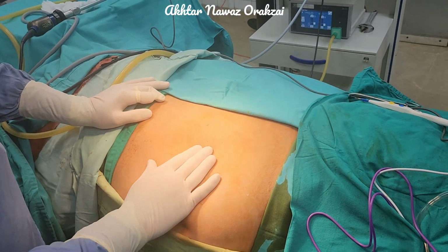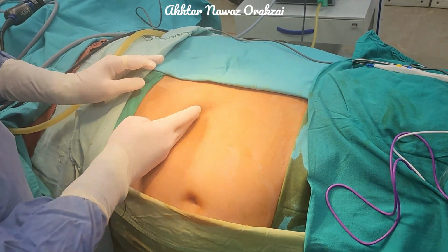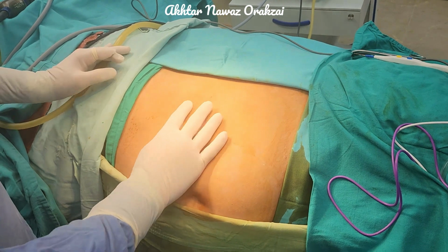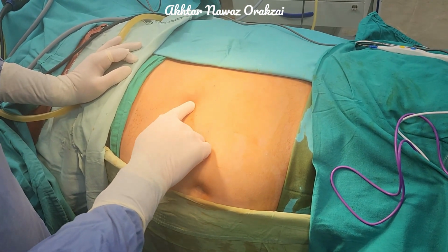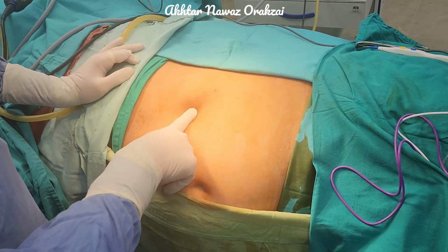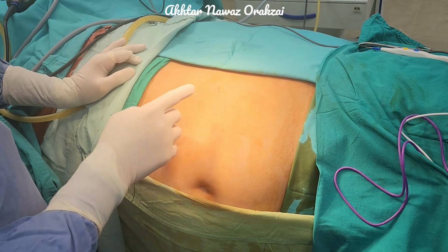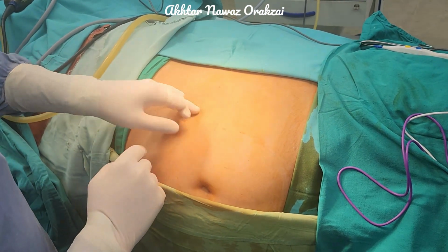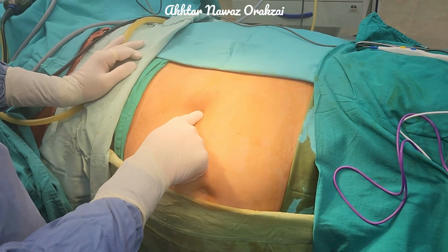First of all, we have to see the landmarks here. Here you can see this is the costal margin and this is the tip of the 9th rib. So most probably this is our target area for the renal hilum. At the tip of the 9th rib we will put in the optical port, 1 finger breadth below the costal margin, the tip of the 9th rib.